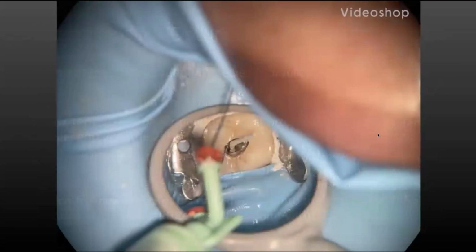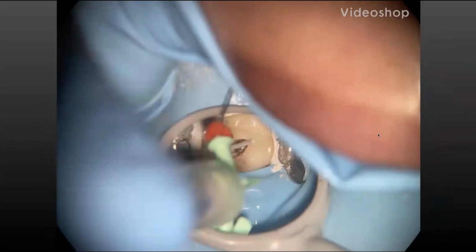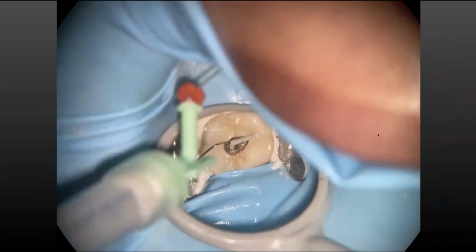So this is an example of basically I kept one canal with the paper point in place, and I'm injecting sealer in the other canal that is confluent. MB1 is confluent with MB2, and the idea is the wicking effect of the paper point is going to pull sealer into that space. So I'm using a Navi tip in this case as opposed to the no waste tip.